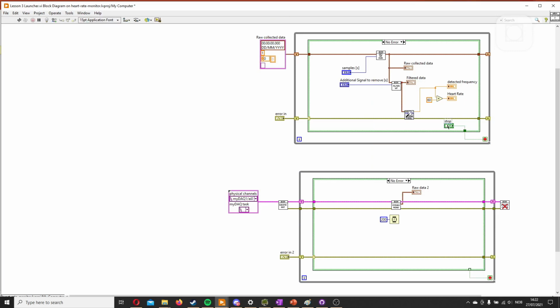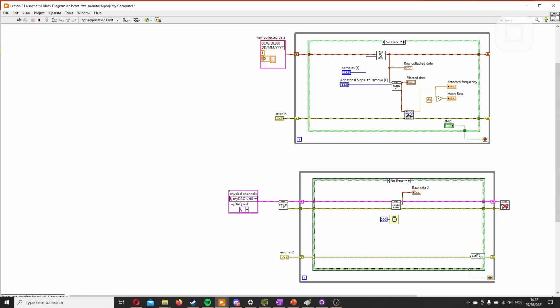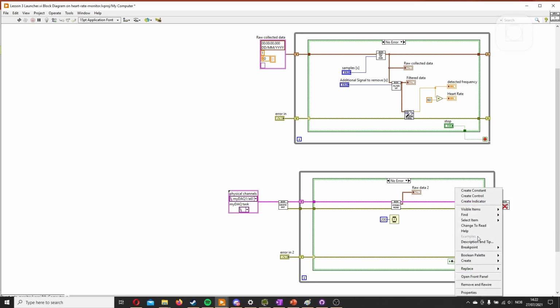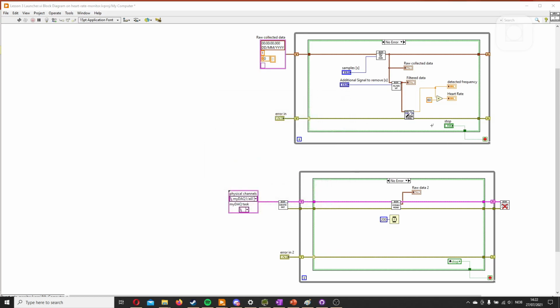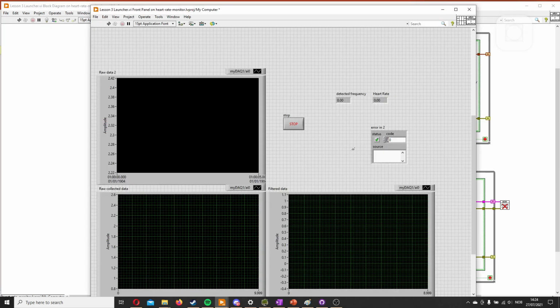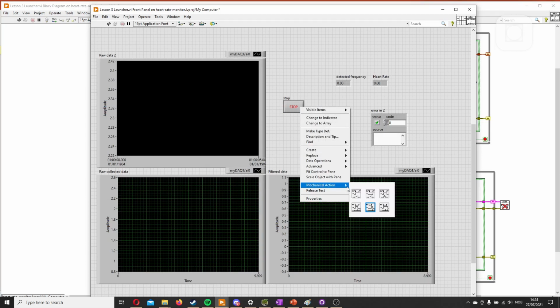We also want the application to stop when I hit the stop button. What we'll do for that is to create a local variable, put it here, change it to read, and in there. Now we will have an additional error here, which says you can't have a latch option with the boolean. This means it automatically pops out. Pressing Ctrl E will get you the front panel. So here we have it. And we need to change this to mechanical switch when pressed.